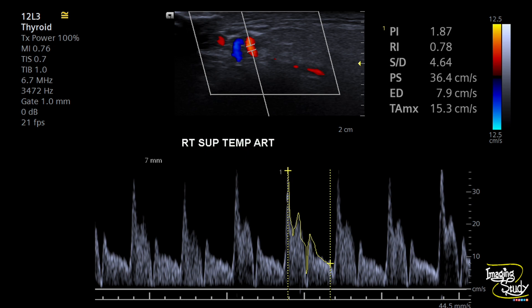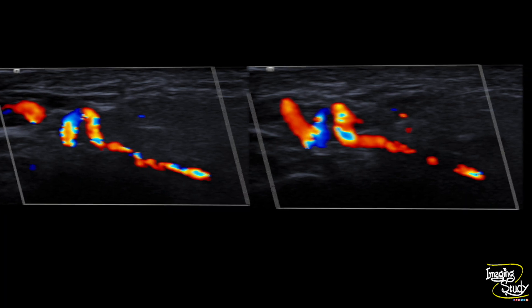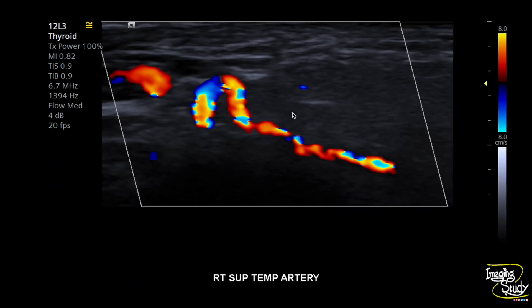Let's see some pictures of the right superficial temporal artery, then we'll jump into the left one. Here you can see the narrowing of the lumen with tortuosity. This hypoechoic area is the wall of the vessel, which is edematous. And in this picture you can see the tortuosity well.